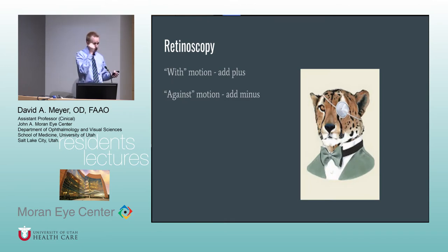So as you all know, if you see with motion, then you have to add plus. If you see against motion, you add minus. That's just a rule to remember: add plus if you see with, add minus if you see against.